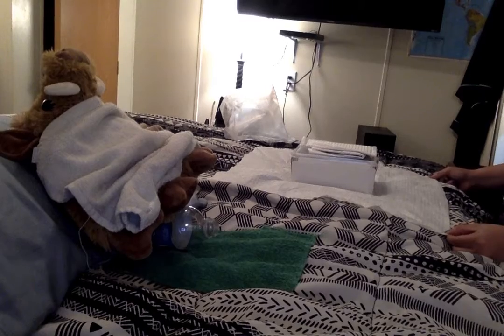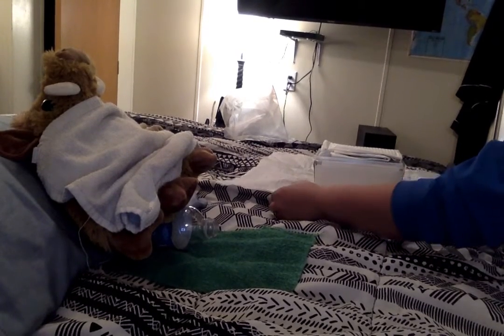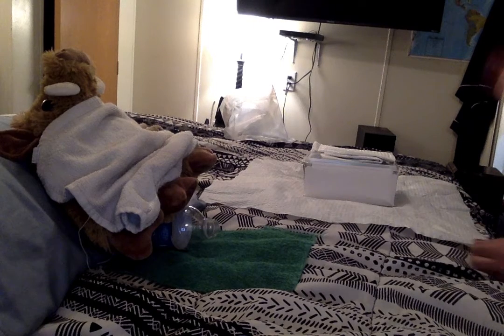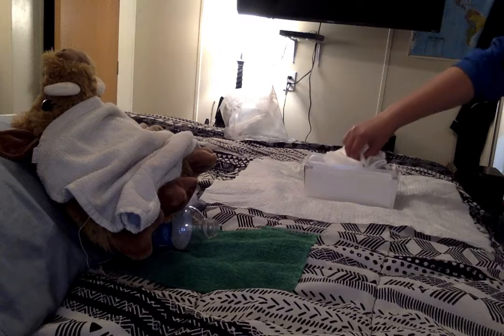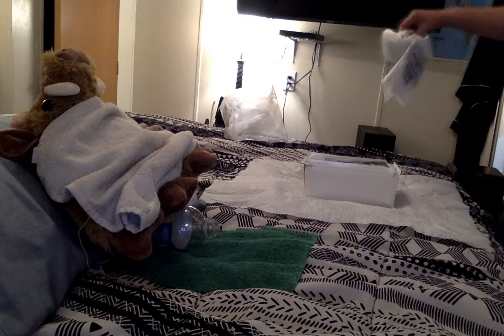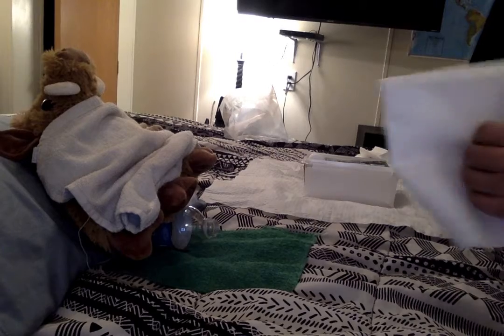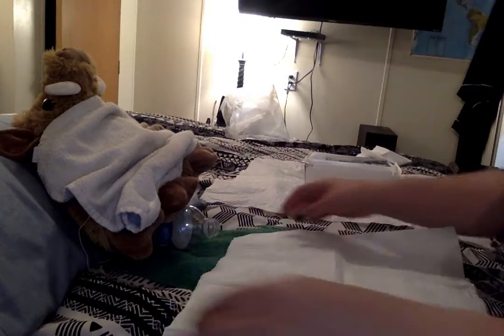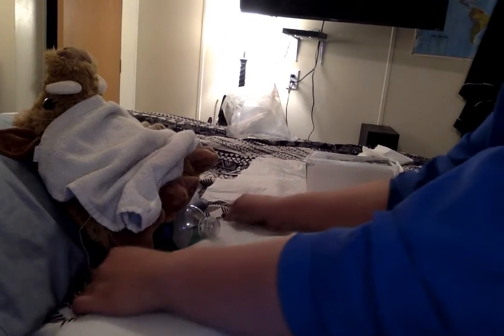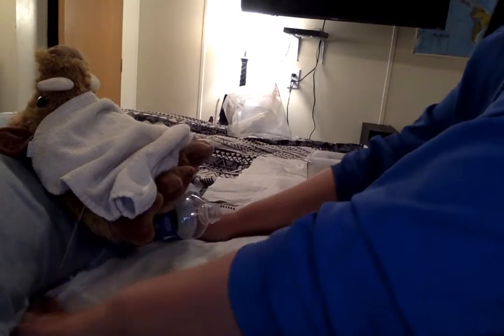And then lastly, we're going to pull the side closest to us down. So now, we're going to use the crane position to get our gloves and our patient's shiny thing. So we're going to open this up, and the shiny part goes face down. We're going to ask the patient at this time, can you please lift your hips? She lifts her hips. This goes straight underneath the patient.